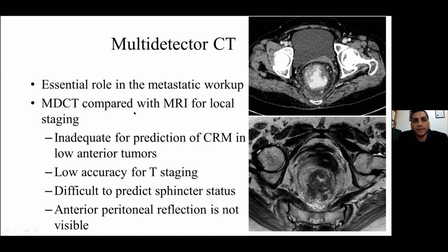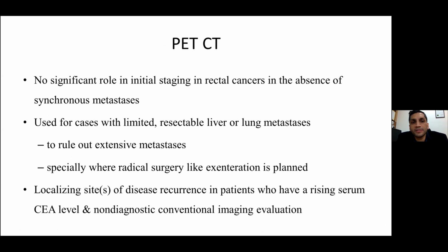In comparison to MRI, the MDCT is inadequate for prediction of CRM and has a low accuracy of T staging. And even it is difficult to predict the sphincter status on a CT scan, and anterior peritoneal reflection is not very well visible.